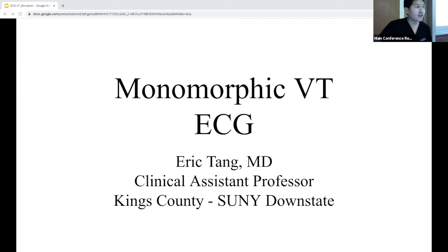Good morning, guys. My name is Eric. I'm one of the attendings across the street at Kings County, former grad from this program. I'm going to be going over basically monomorphic VTAC, most particularly the ECG features of VTAC.